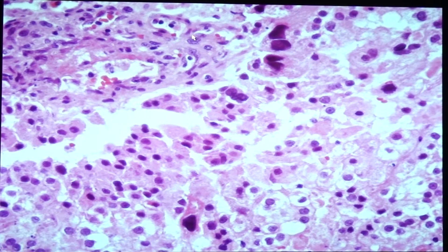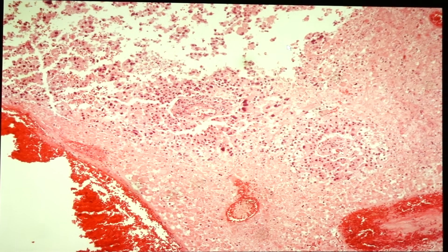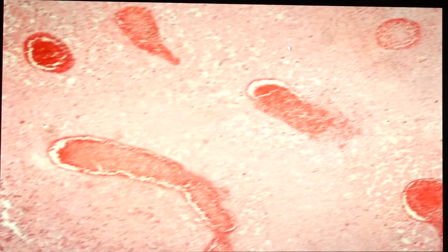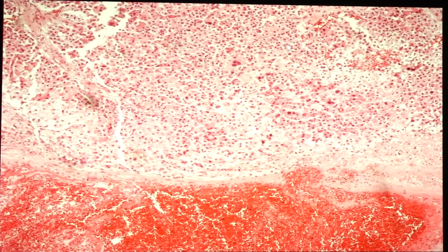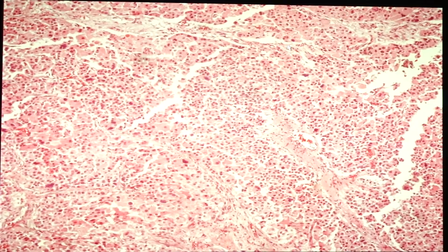In adrenocortical carcinoma you can also identify areas of hemorrhage and necrosis. There is irregular nuclear membrane and binucleation. These features — hemorrhage, necrosis, and marked pleomorphism — are key differentiating features from adrenocortical adenoma and adrenal hyperplasia. Those are all the slides for today. Stay safe and good night.